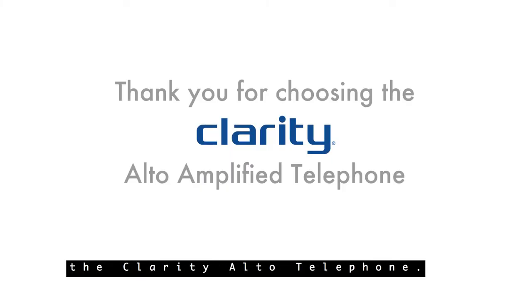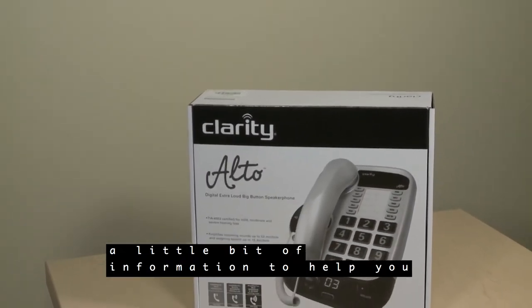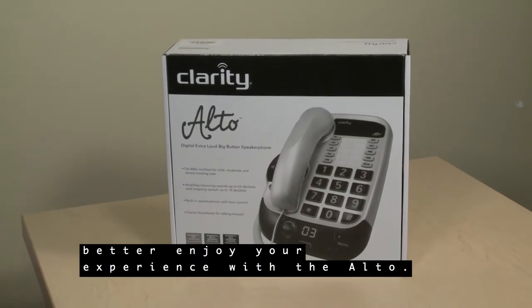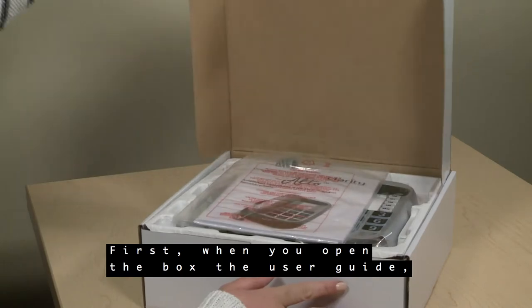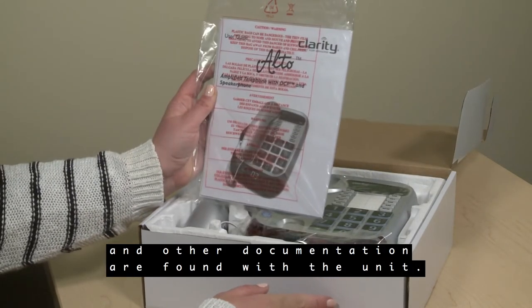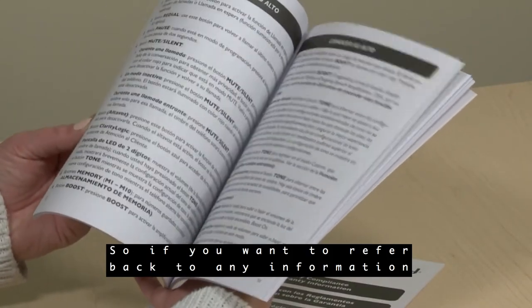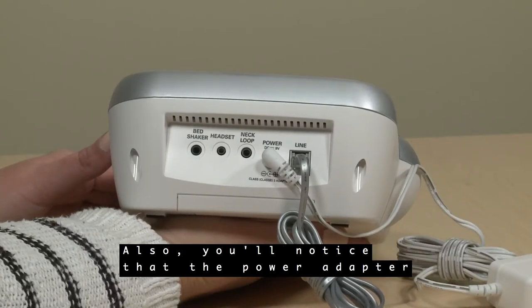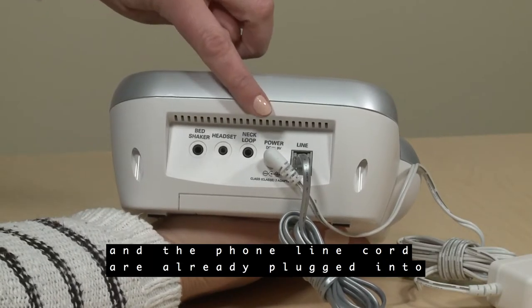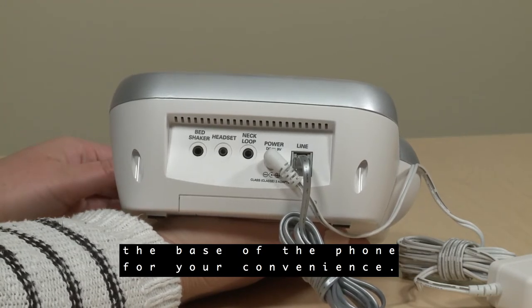Hello and thank you for choosing the Clarity Alto Telephone. We hope you enjoy our product and want to give you a little bit of information to help you better enjoy your experience with the Alto. When you open the box, the user guide along with the quick start guide and other documentation are found with the unit. So if you want to refer back to any information we cover in this video, it's all there for you. Also, you'll notice that the power adapter and the phone line cord are already plugged into the base of the phone for your convenience.